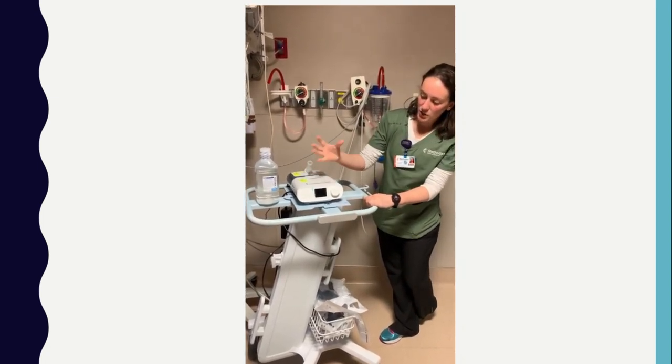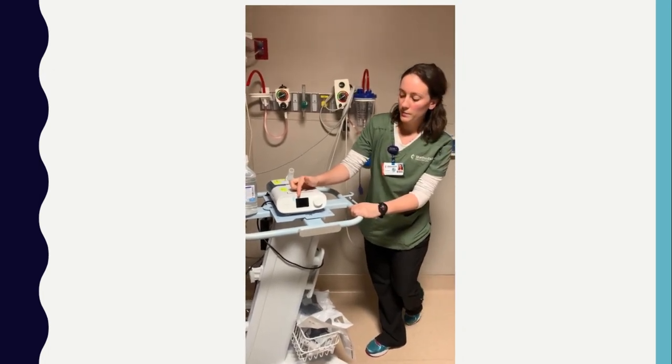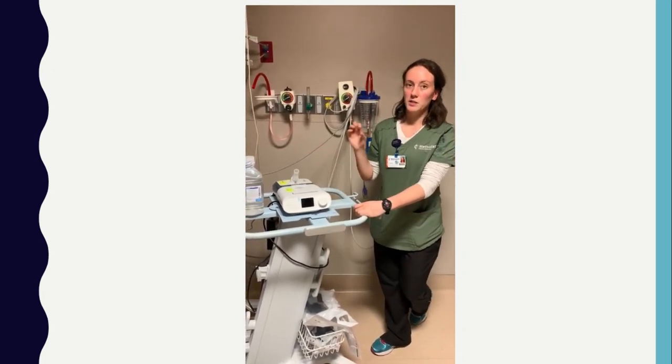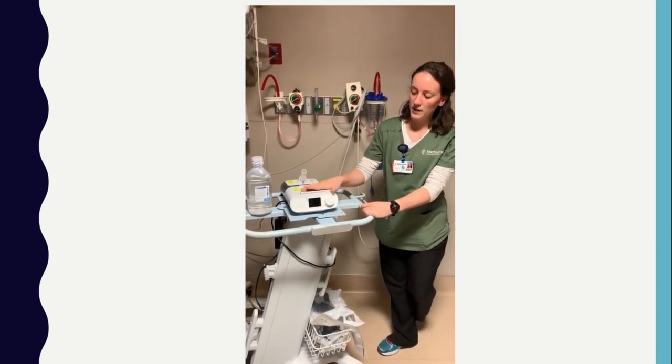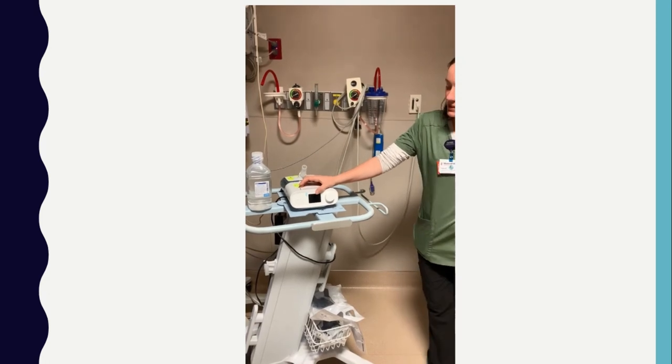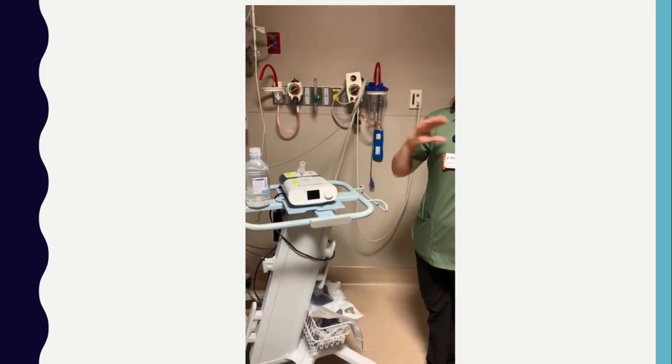Other than that, your power button's going to be right here. You just press it, it'll turn on. And when it turns on, it's going to show you the pressure that they're using right here. Now, we call this our patient setting. There's no way to adjust the settings when they're on that mode right there. So whatever the CPAP was set at, which should be their ordered settings, it'll pop up right there for you, and the patient cannot adjust that at all.